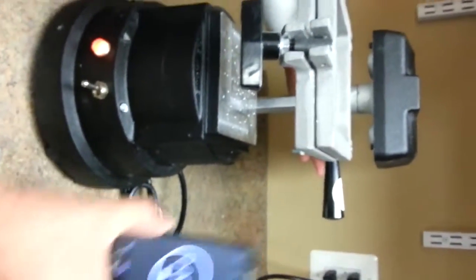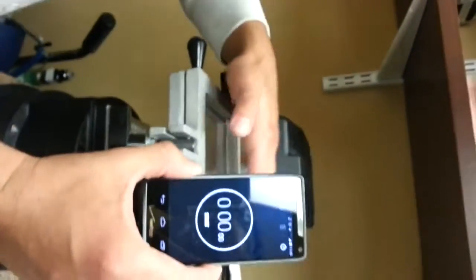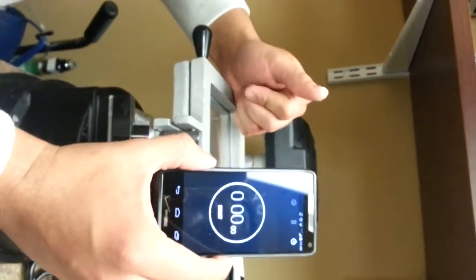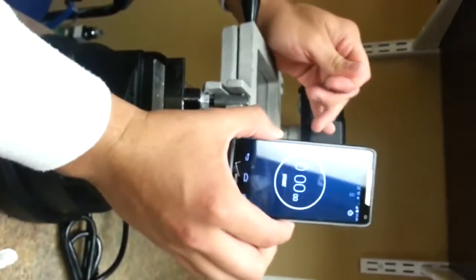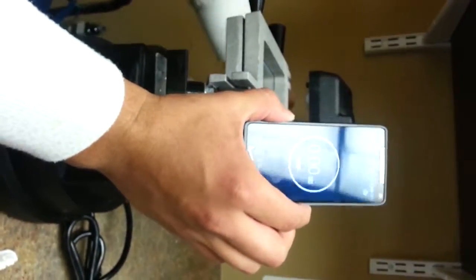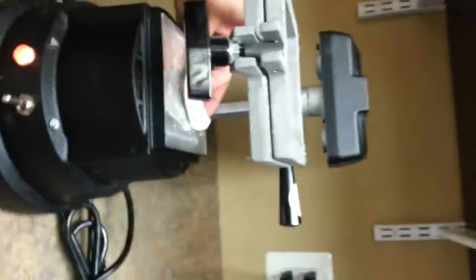Again, we have our timer over here. We're gonna leave the heater on top of the plastic for about 2 minutes. Okay, sometimes it takes a little longer, sometimes a little less. So just bear with me here. Now, once it heats up, it's going to take about 2 minutes. Again, our model is going to be right underneath here.